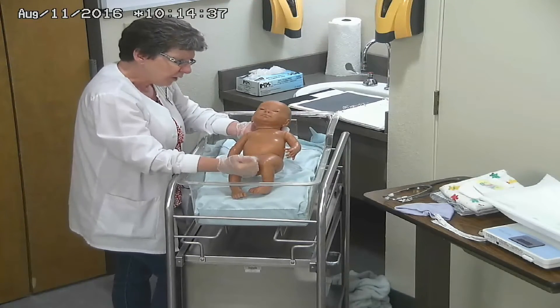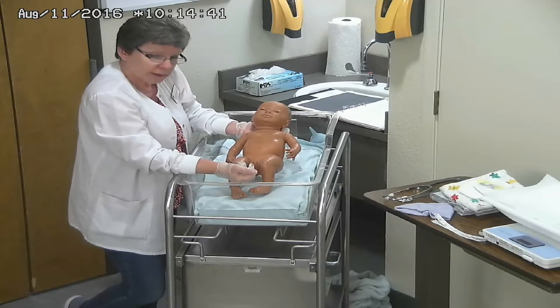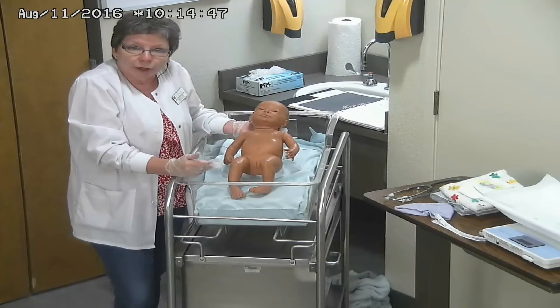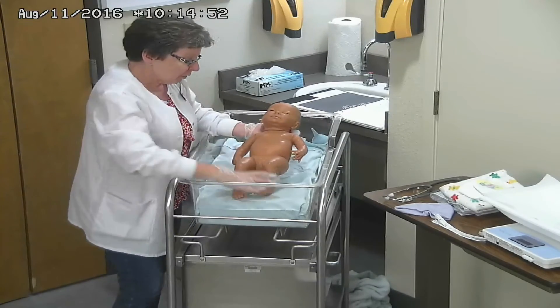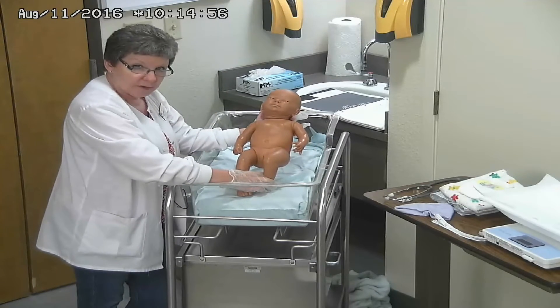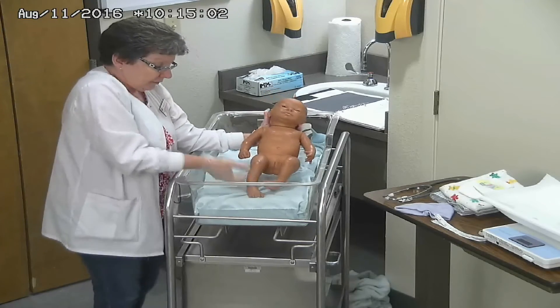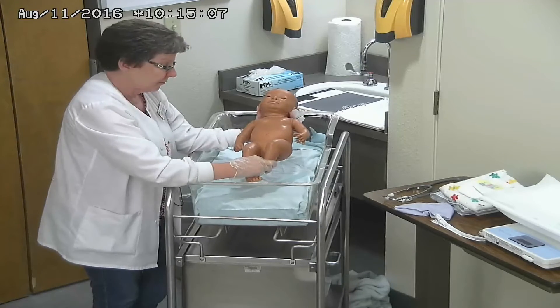We're going to talk more about the APGAR score later, and you'll have lessons on that throughout the semester and also in clinical. Now we're going to start measuring the baby. What is one thing that parents all want to know? They want to know how long the baby is and how much he or she weighs. When picking the baby up, I always put the palm of my hand on the back of their neck, with my thumb and fingers on either side of the head, and grab their feet and hold them together.